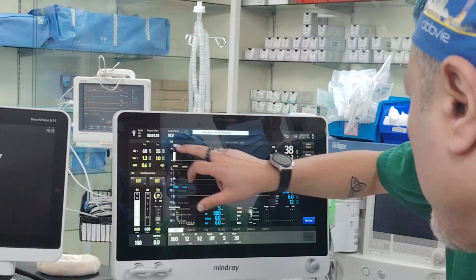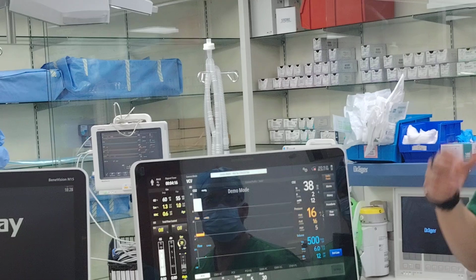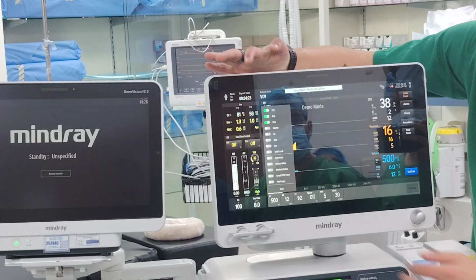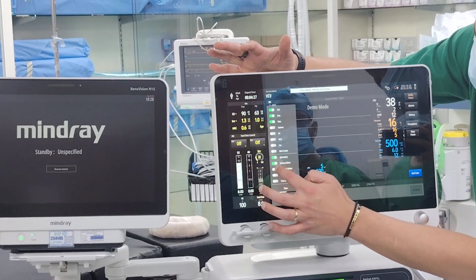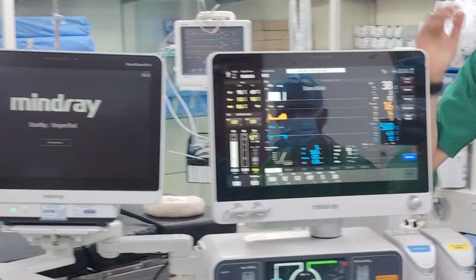So, very good. What if today I'm a doctor who wants to look at more advanced parameters, more detail? I have a very long case. So this is the normal layout. What you can do is click here, and then you can activate the first 4 down there, which is very important. Let me show you: 1, 2, 3, 4. You have spirometer, volume, mechanical values, and the compliance trend. And I'll explain to you one by one how you can use it.